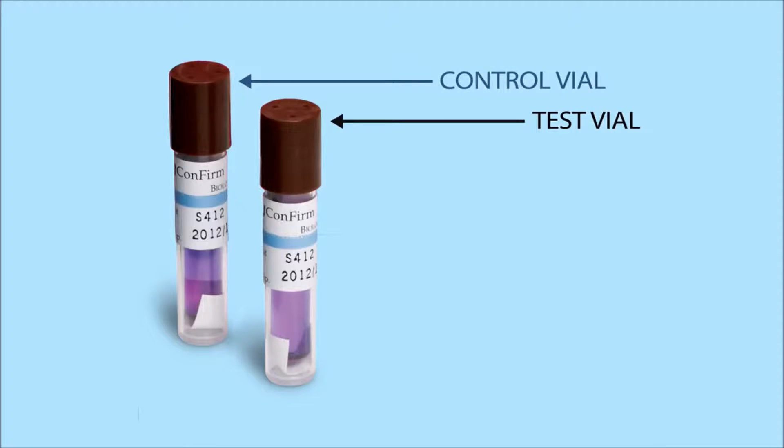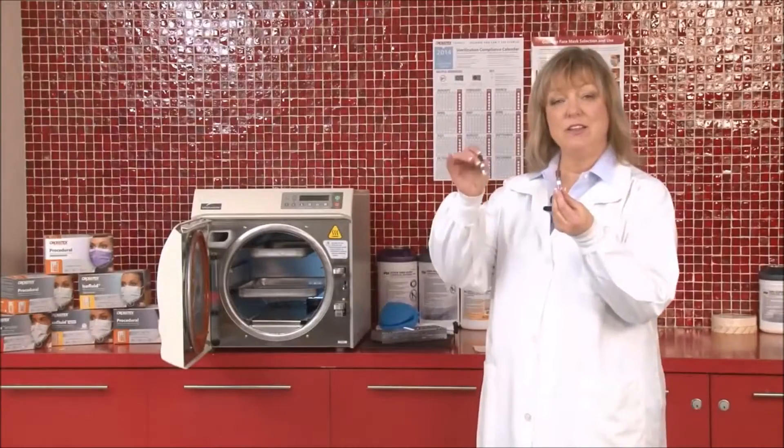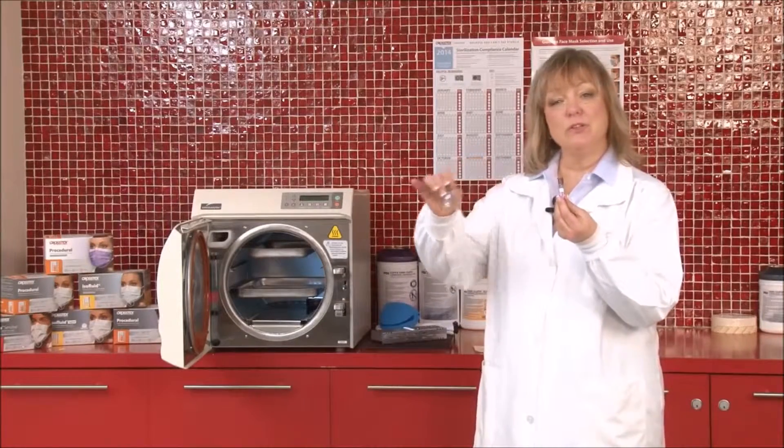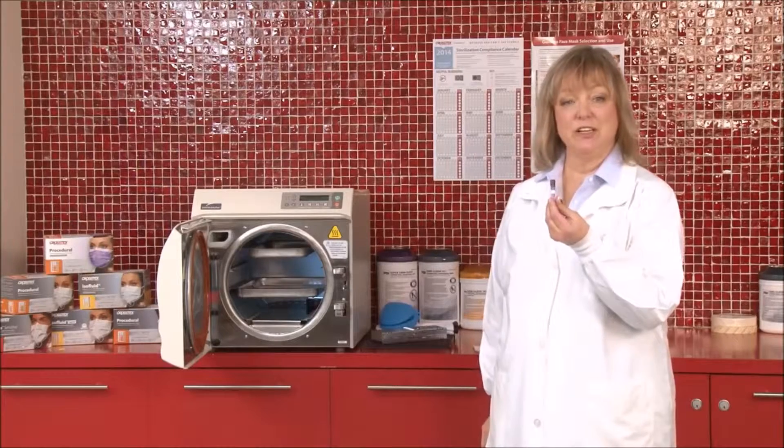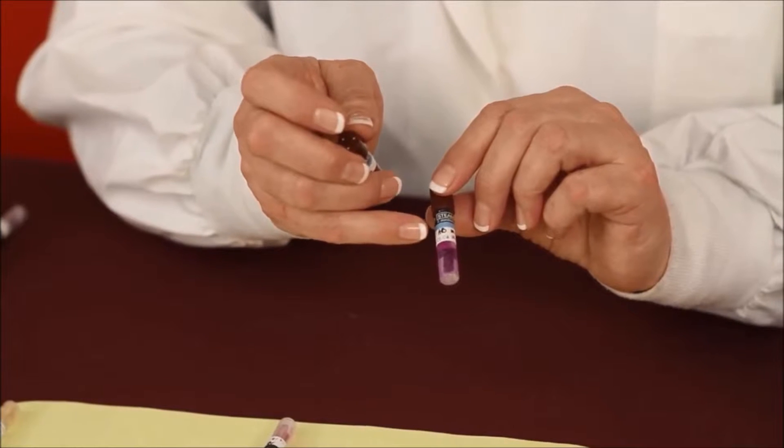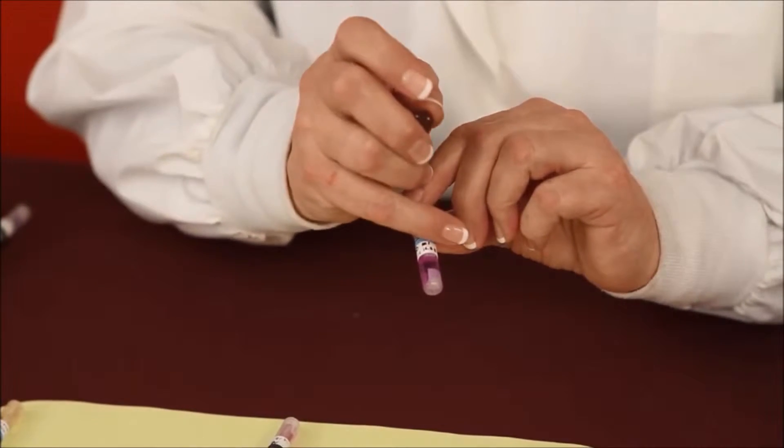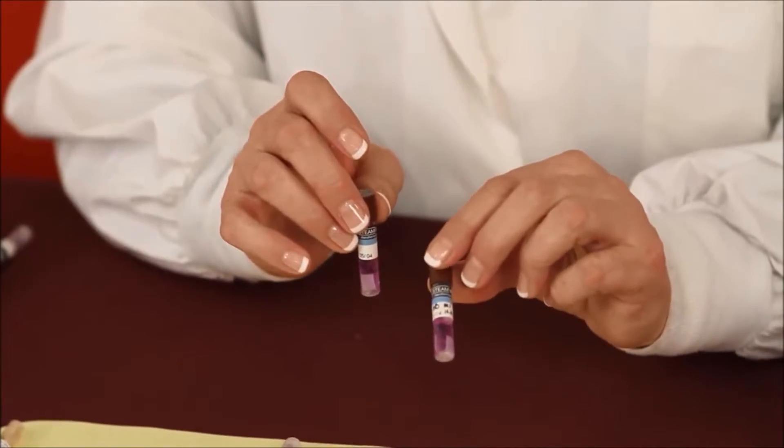One of the vials is going to actually be placed into the sterilizer as your test. The other one is going to be your control. So this one will not be placed into the sterilizer. It's important that you write certain information so that you can identify the brand of the sterilizer, the run of the day, the date, and the operator's initials.